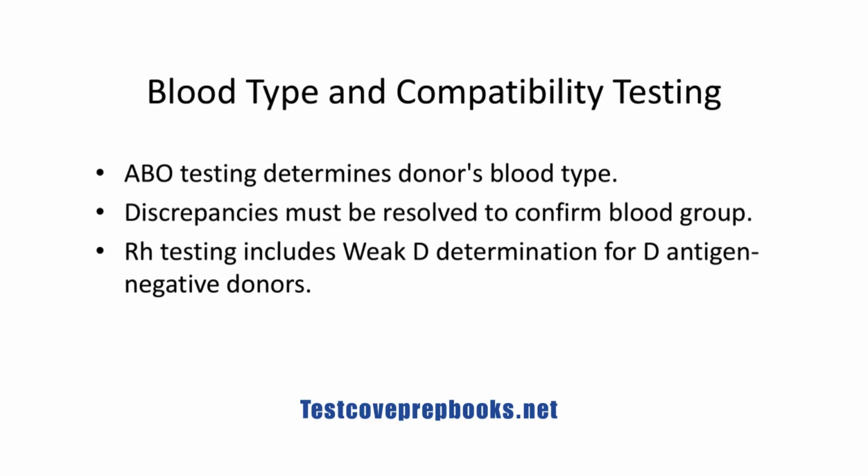Following this, Rh testing is performed, including a special procedure called weak D determination for donors who initially test negative for the D antigen. This helps identify individuals who may have a weak expression of the Rh factor.